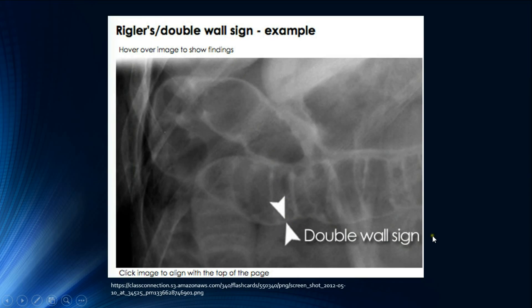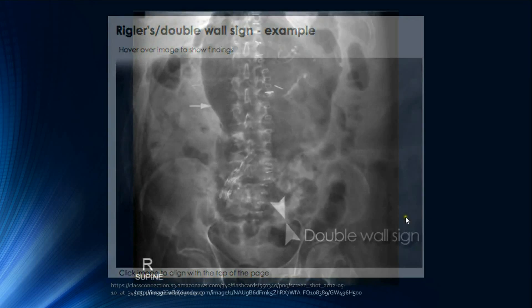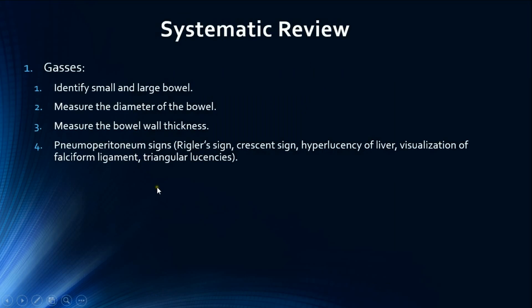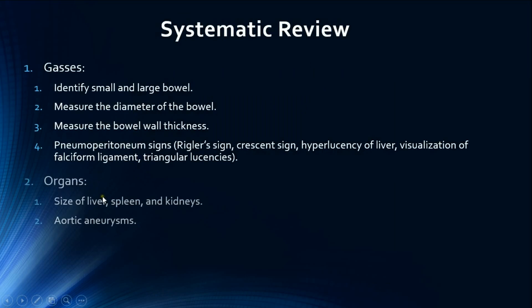Other pneumoperitoneum signs include hyperlucency of the liver, triangular lucencies, and visualization of the falciform ligament. Here is an example on a supine AP radiograph showing free air centrally — because the patient is supine — and surgical staples indicating a prior laparotomy.